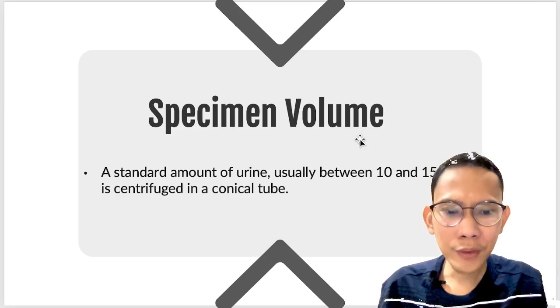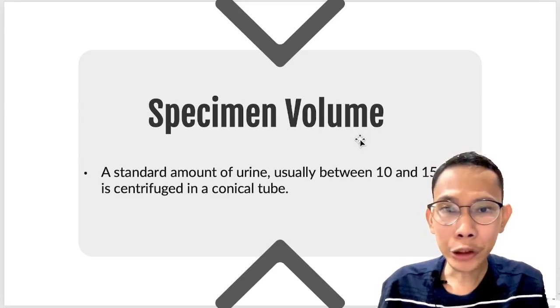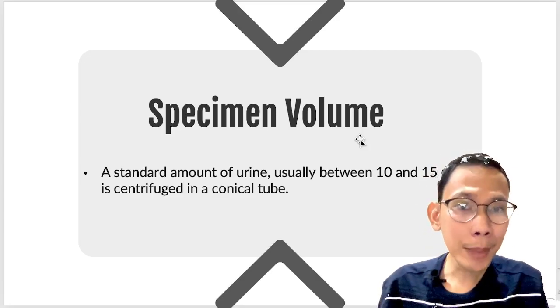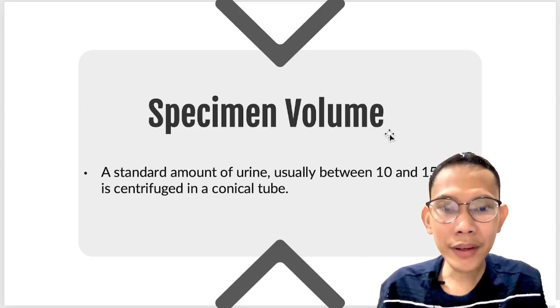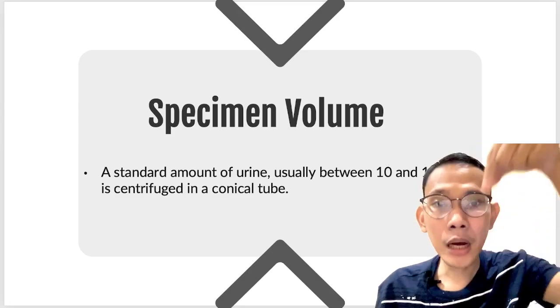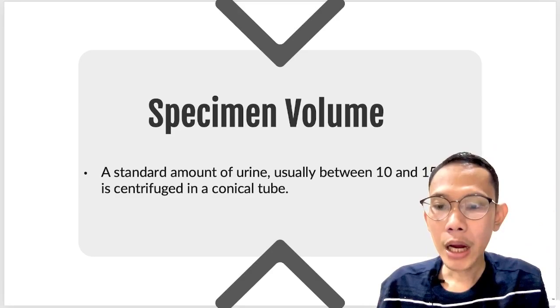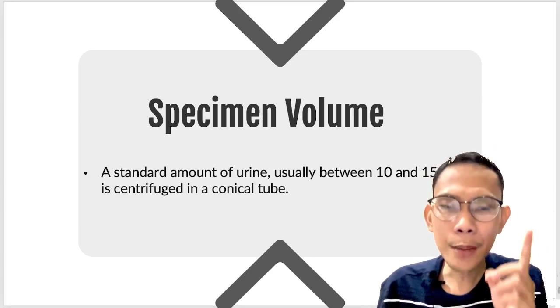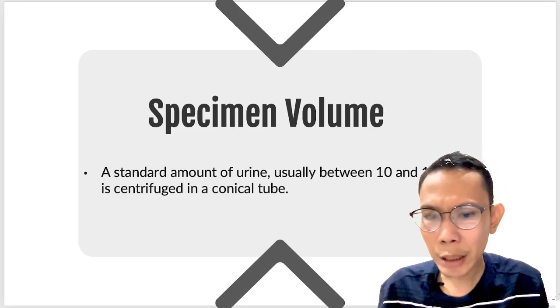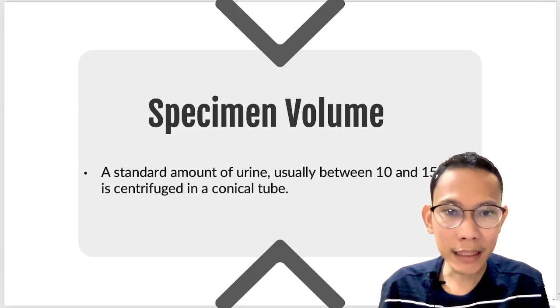And a 12 ml volume is frequently used because multi-parameter reagent strips are easily immersed in this volume. So remember your chemical testing. So if you have an adequate amount or most probably 12 ml, it's a lot easier to dip now your entire reagent strip. And also, if for example, the patient cannot provide a 12 ml sample, for example, your pediatric patient, the volume of your specimen must be noted sa ating report form.